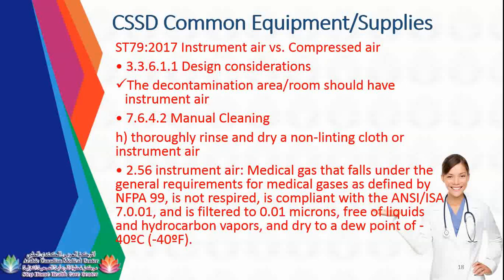So, the decontamination area room should have instrument air. Actually, guys, it's in the preparation and packaging area, because in prep and pack, you will dry the instrument there. So manual cleaning, thoroughly rinse and dry with a non-linting cloth or instrument air. Usually, they are using either paper towel if you don't have instrument air.